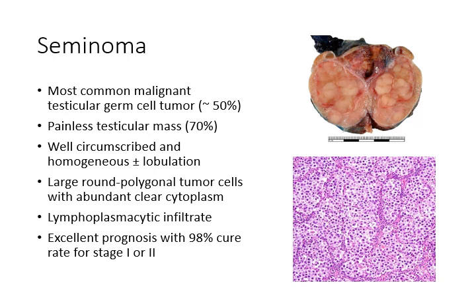Down the microscope we have these nests of tumour cells that look not unlike the dysplastic germ cells in germ cell neoplasia in situ. They're rather round or polygonal cells, and they have quite a lot of cytoplasm. And what's often characteristic is in these tumours they sit in nests, and there are cords between the cells with lots of lymphocytes and plasma cells.